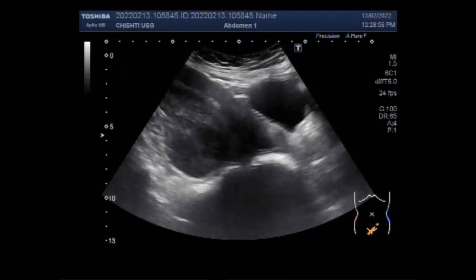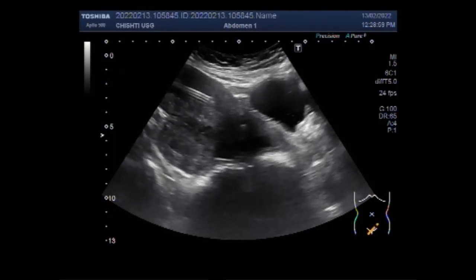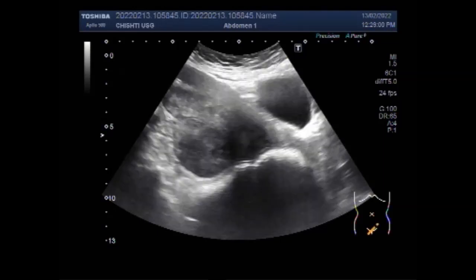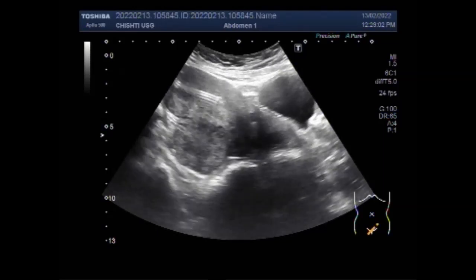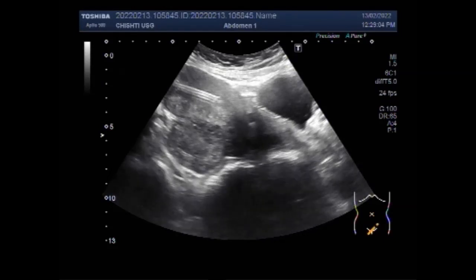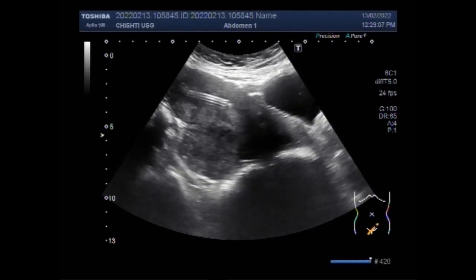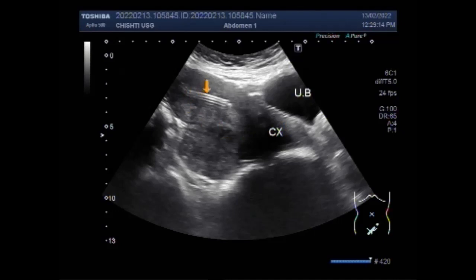You can see the uterus, urinary bladder, and an intrauterine contraceptive device that is normally placed inside the uterine cavity. This is the urinary bladder, this is the cervix, and this one is the intrauterine contraceptive device.